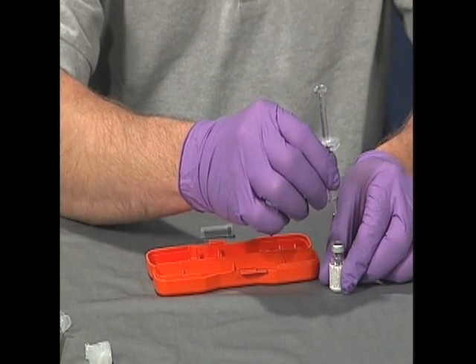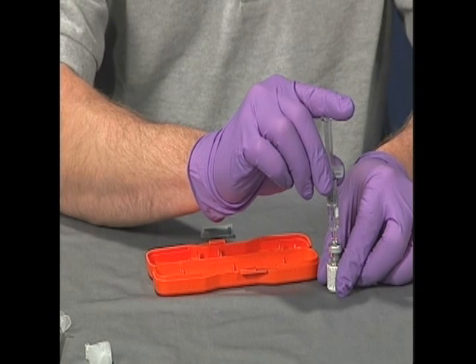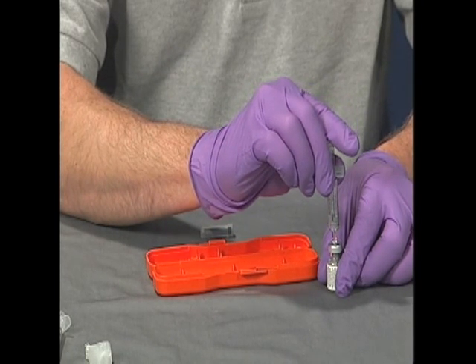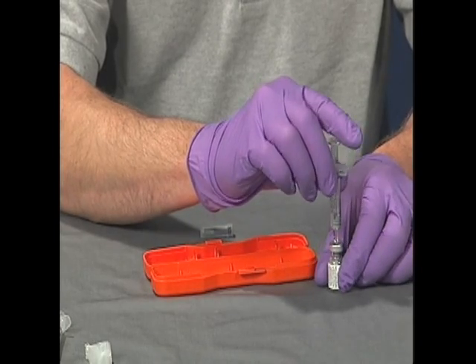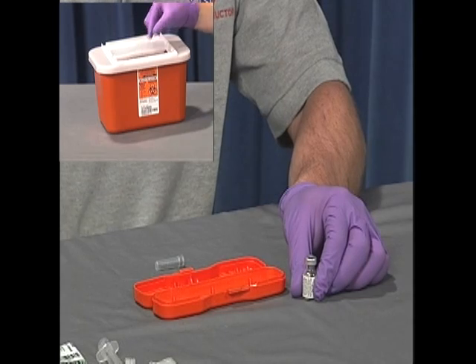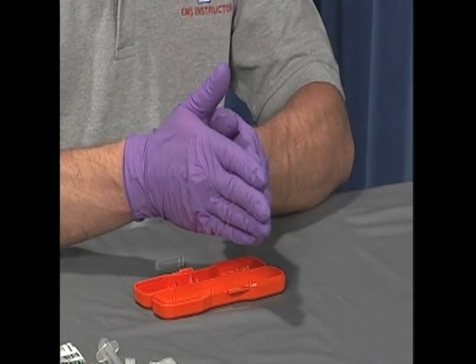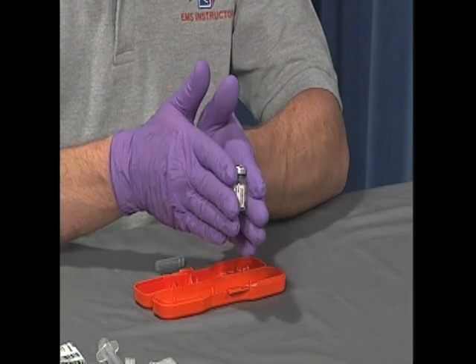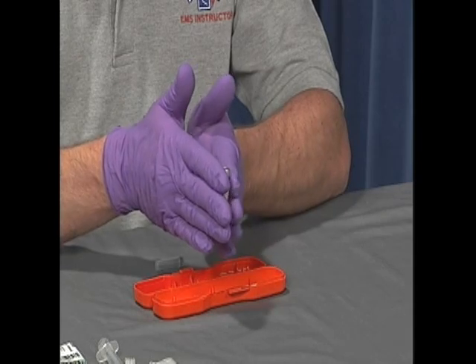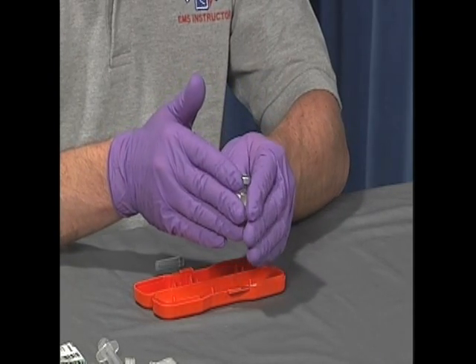Pierce the center of the medication vial's stopper with the needle on the syringe of the diluting solution and inject the diluting solution into the vial. Remove the needle and syringe from the vial and place it in the sharps container. Now reconstitute the drug by gently rolling the vial to assure that the medication dissolves. It should become a clear solution.